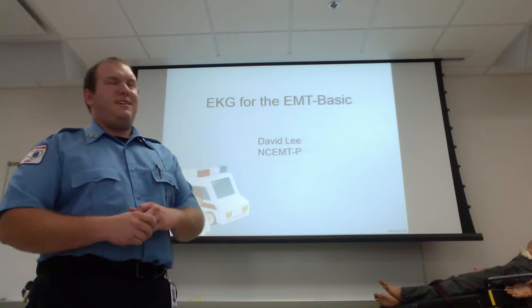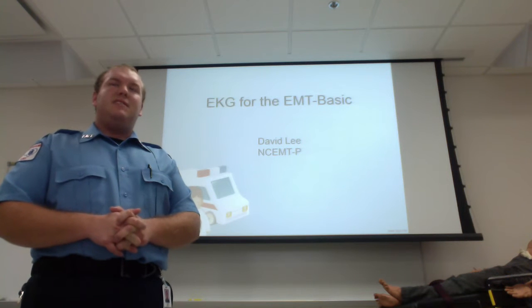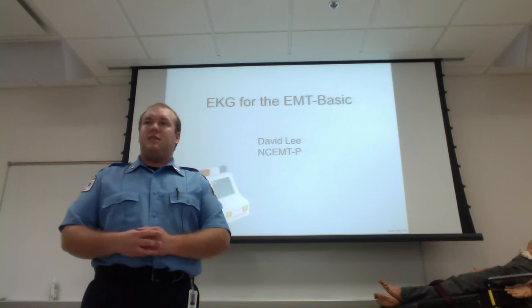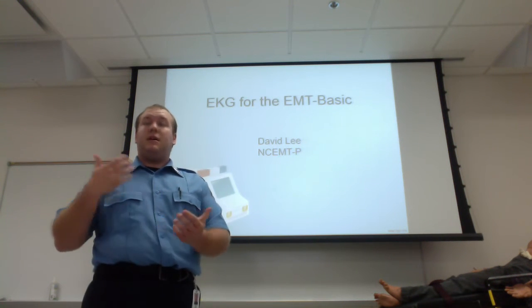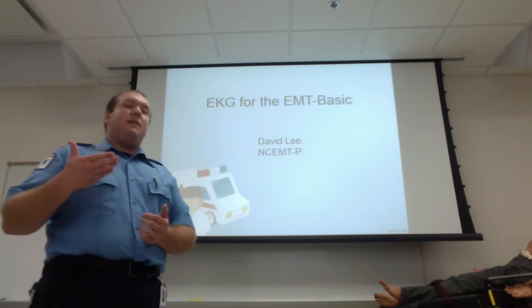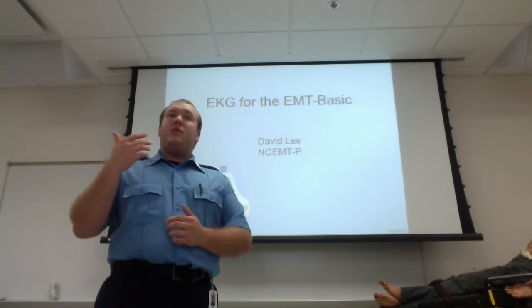Recently, I got the pleasure to attend a Bob Page conference, and as part of that conference, they talked about the number one advantage and the number one push right now: having the first medical contact to a chest pain patient or possible STEMI patient be the one to apply that EKG. Granted, it may not be the one who can actually interpret it, but at least we can get it acquired first.